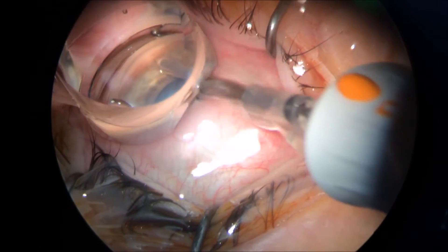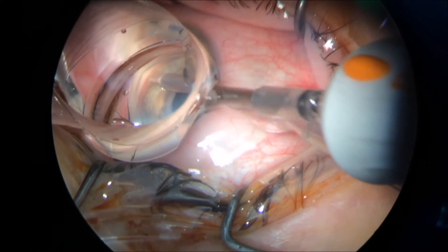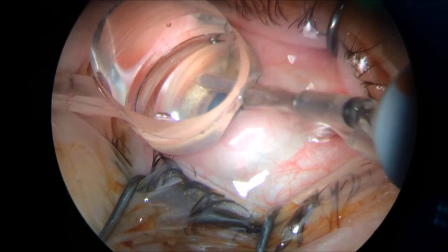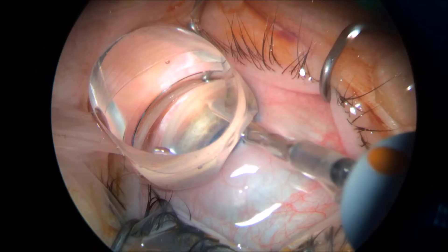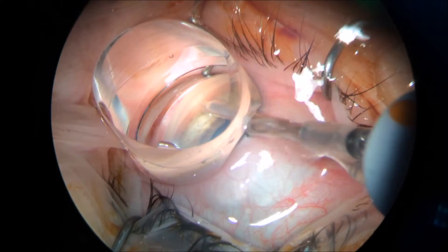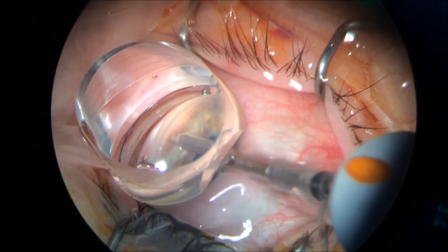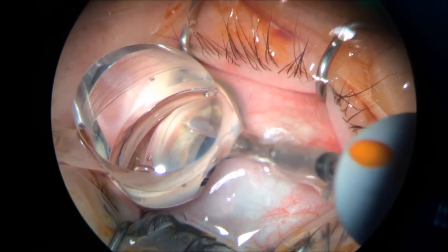Dear colleagues, this is a new glaucoma MIGS procedure. Notice that the pigment from the trabecular meshwork is getting removed. In the area where the procedure was done, we have a nice, cleaner trabecular meshwork compared to the area where the procedure was not done yet.